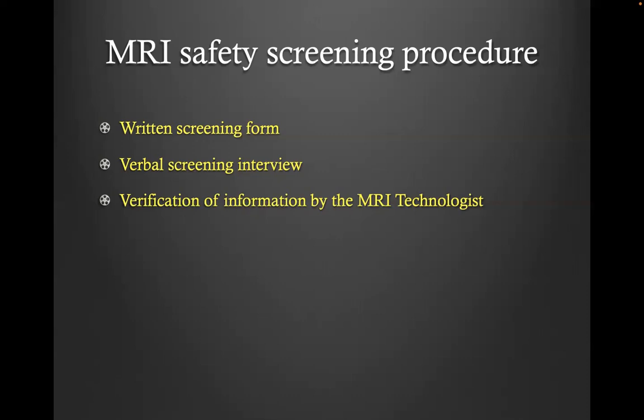And also, it's extremely important that you go through the checklist with your patient. You cannot assume that they understand every single question being asked on the checklist. Then something gets unscreened and leaked to us, and then we have to turn them away. And you definitely don't want to do that.